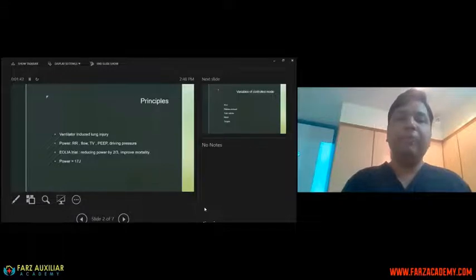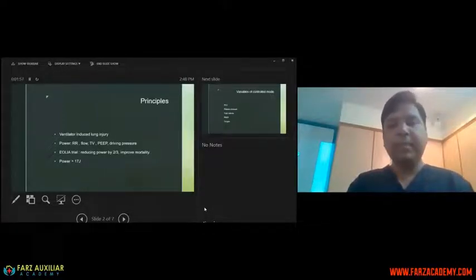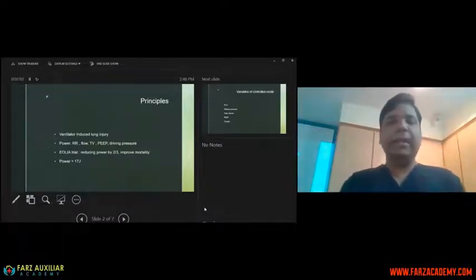And if you look at a patient whose mechanical power for ventilation is more than 17 joules, that is associated with death. The recent EOLIA trial on ECMO patients has also shown that if you can reduce the mechanical power of ventilation by 2/3, you can actually make a significant change in the mortality. But the study was not powered or meant for this particular question.